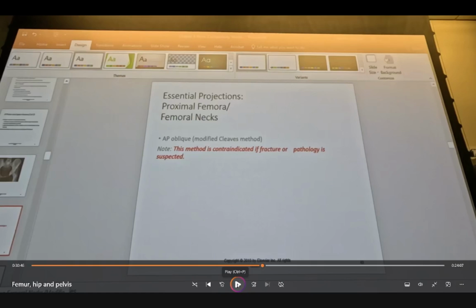If you roll the patient back flat and their foot on that affected side is externally rotated all the way up until it's on its side, then that's a good indication the patient has a broken hip or potentially femur as well. So if both of those potential positioning things exist, this is not what you're going to do for a lateral.